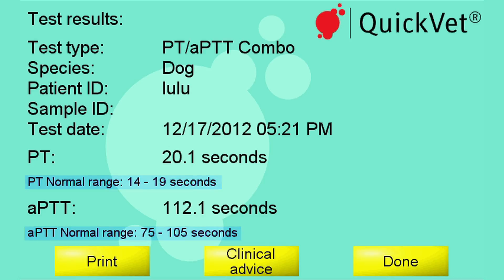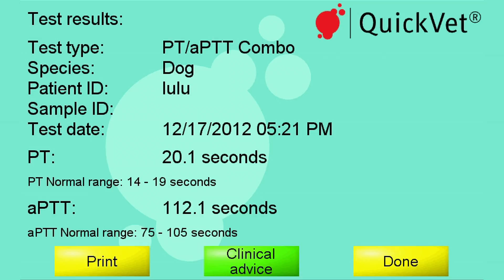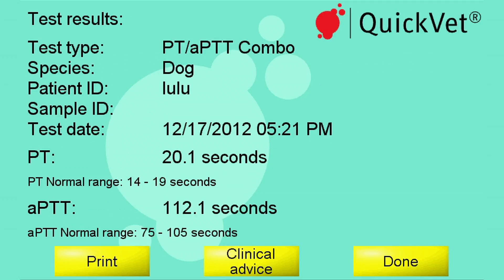If you need advice on a possible diagnosis, push the clinical advice button and QuickVet will present potential diagnoses depending on whether PT and/or APTT are prolonged. You can print the result by pushing the print button.